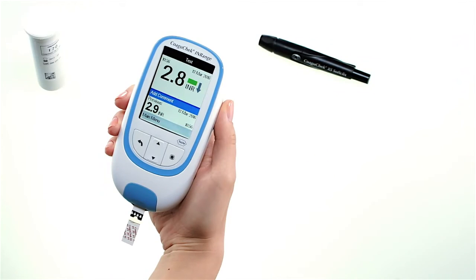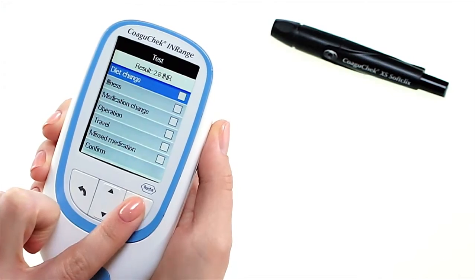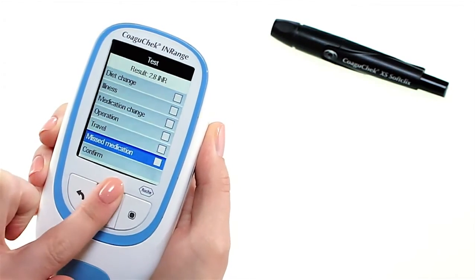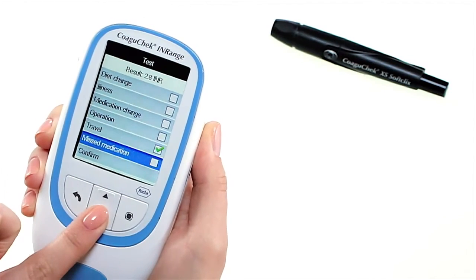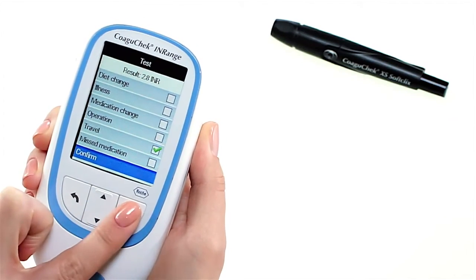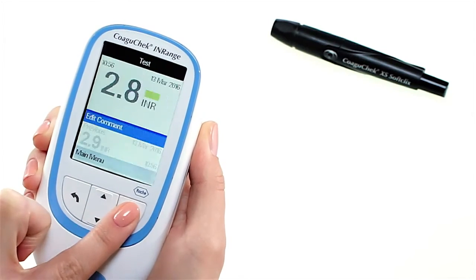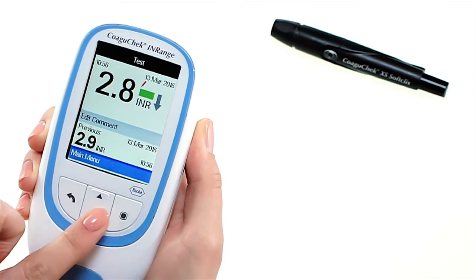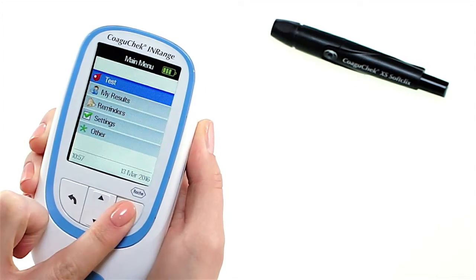If you wish, you can add up to six predefined comments to a test result. Comments can, for example, provide additional information about the test conditions or your general state of health, to help you understand what could impact your result. These comments can only be added immediately after the test result is displayed and before the meter is powered off. It is that easy! Press and hold the enter button until the meter powers off.